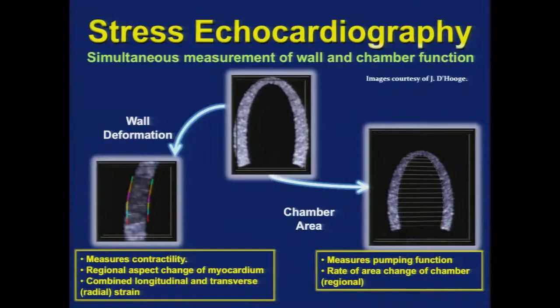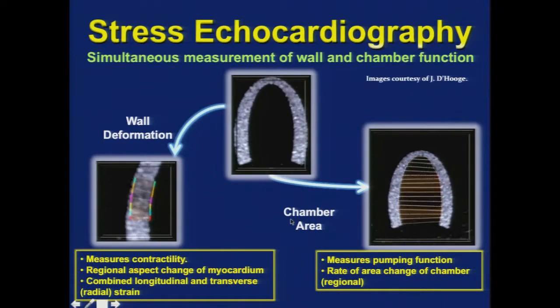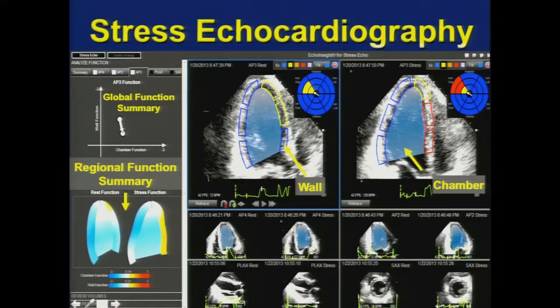We can look at a stress echocardiogram, or perhaps we can look at things like chamber area change or EF. We can look at parameters of wall deformation, and instead of looking in October and January, we just look at rest and stress. We superimpose these parametric displays of function and get some estimate of whether or not we believe there's truly a wall motion abnormality. So it gives us an objective parameter with which to either confirm or dispute our visual assessment of wall motion and perhaps decrease the intra-observer variability.